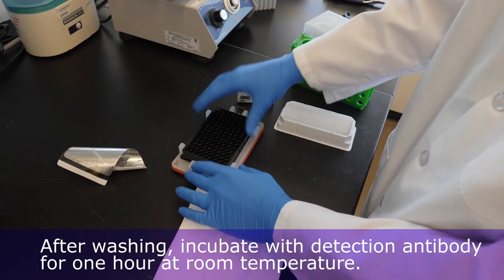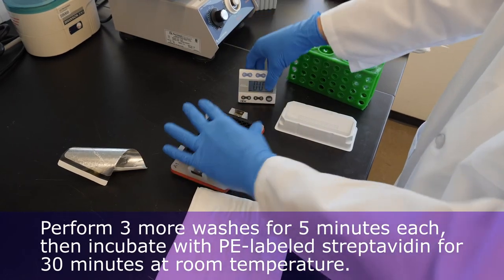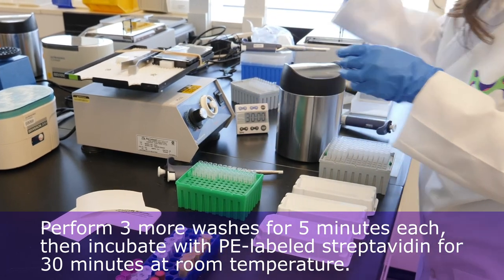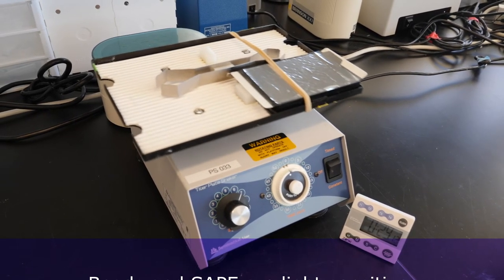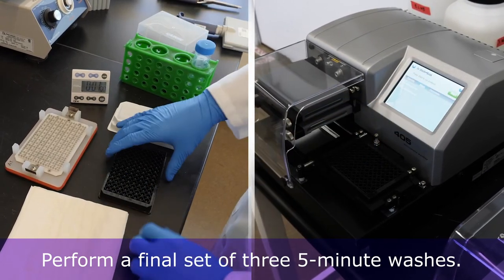After washing, incubate with Detection Antibody for one hour at room temperature. Next, perform three more washes for five minutes each. Then incubate with PE-labeled Streptavidin for 30 minutes at room temperature. Remember that beads and SAPE are light sensitive. Finally, perform a final set of three five-minute washes.